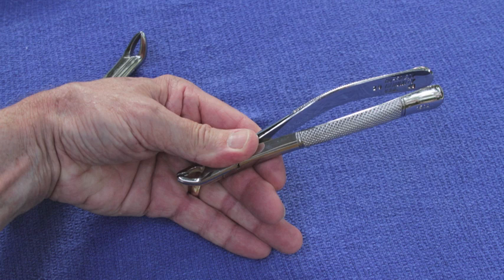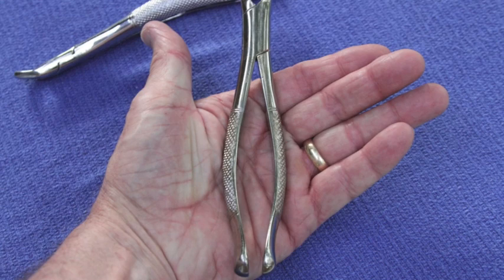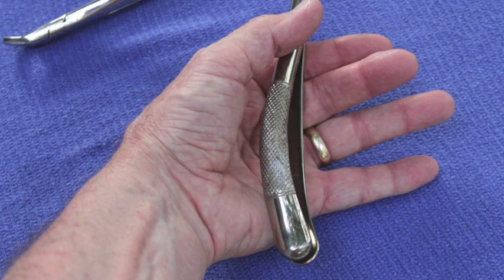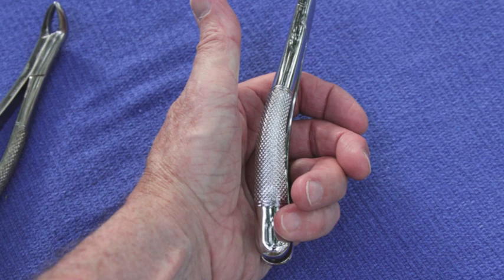As is illustrated here, you can see that the assistant is holding the instrument by the hinge. This way, the handle is made available to the doctor. When placing the instrument, understand the general curve of the instrument, the curve in the handle, is going to be placed into the hollow of the palm. So it doesn't really matter what instrument that you're going to be placing. If the handle has a curve, it will be placed into the hand the same way.